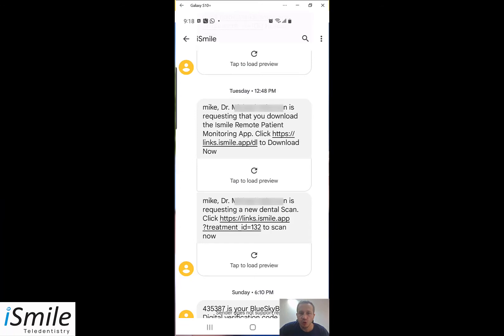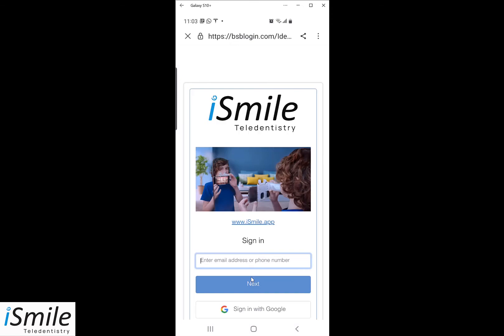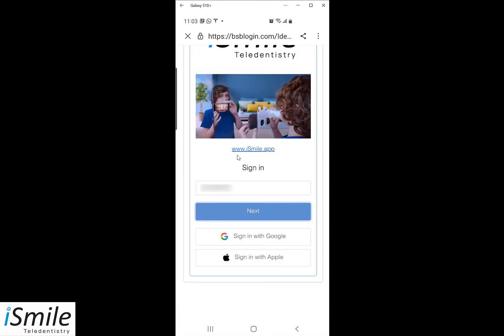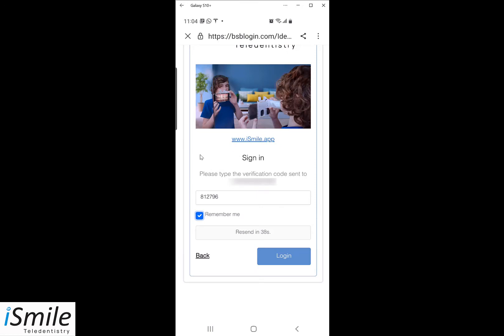Every time the dentist requests a new dental scan you will receive a text and email message — that is the second message we see on screen here. What you need to do is open the app to perform the relevant scans. The fastest way is to click on the link in the second text message. Click 'Start iSmile Monitoring' and you will be brought to a login screen. Simply enter your cell phone number, click next, wait for the confirmation code, enter it into the box, tap 'Remember Me,' and log in.